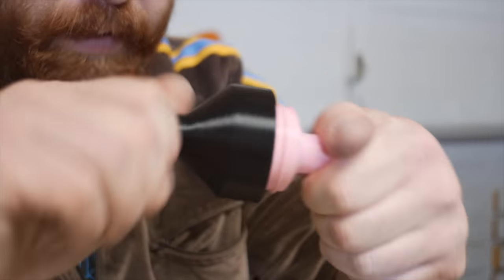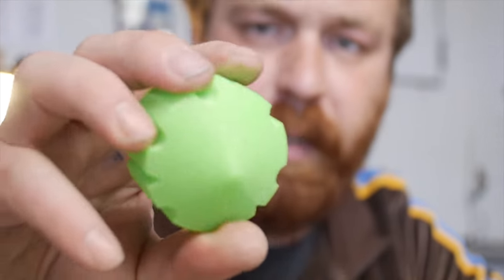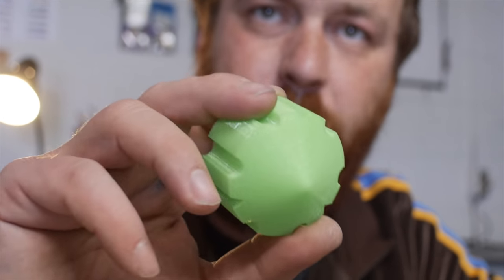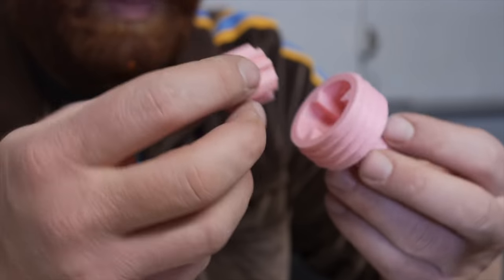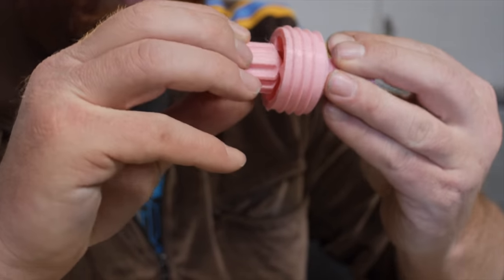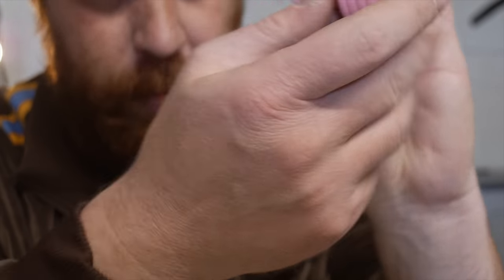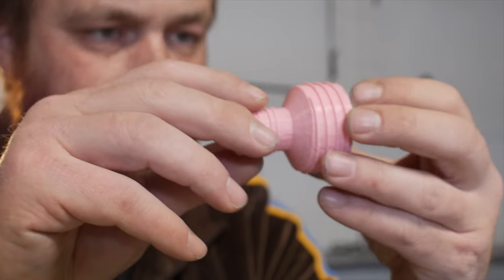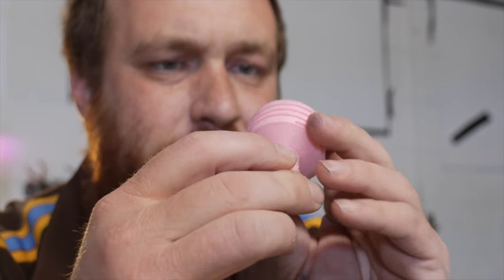Okay, so this original valve that we built was supposed to be a very simple check valve, but we had some issues printing TPU, which is a squishy material, and I don't like this design because not everybody can print TPU or even get their hands on the material, although it's pretty common. We have a PLA slug in here, and supposedly when you pull suction on this, this point will plug the hole, but it's just not fine enough tolerances.